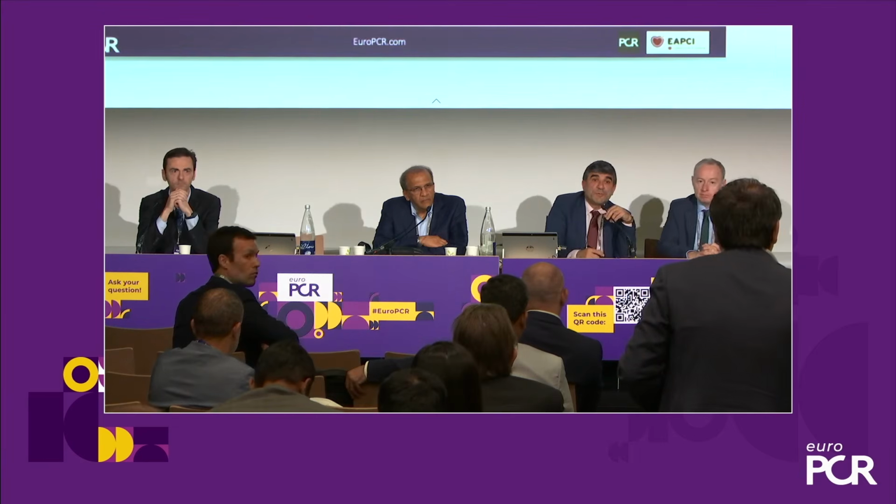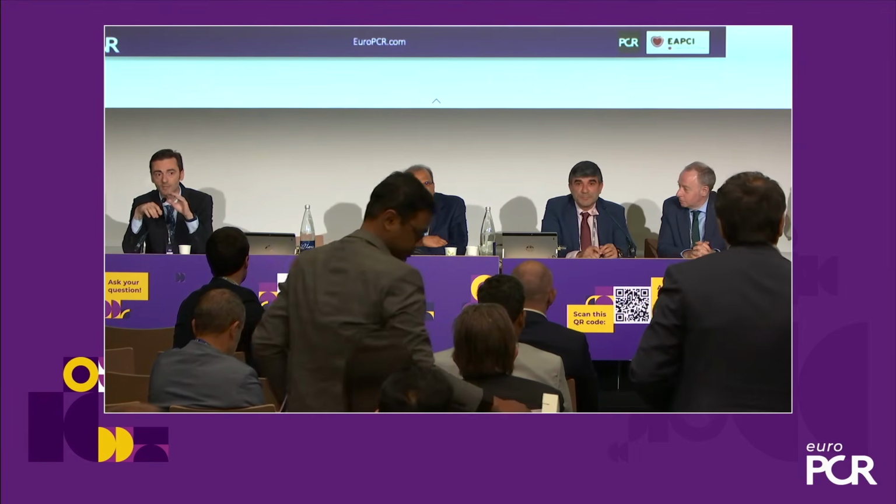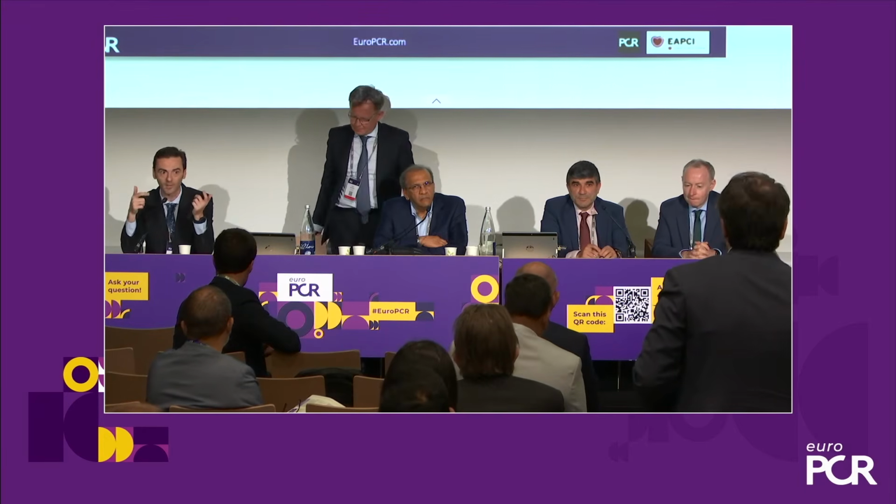Thank you. You have a comment or a question? Three short questions. First of all, is it safe to use ELCA subintimal? It's a very good question, in my opinion. We don't know, but you don't have another chance. So this was my point in this case. I use saline instead of blood or contrast, and just a small amount of energy just to make it crossable, because we don't know if we cross extraplaque or intraplaque there.